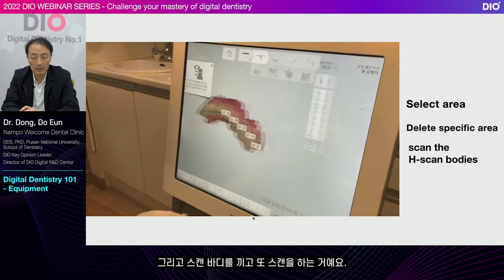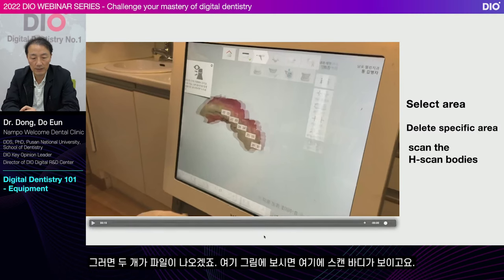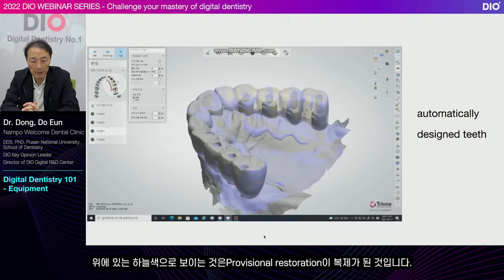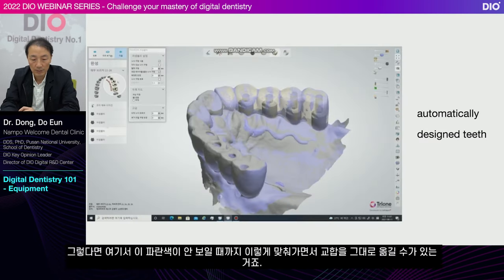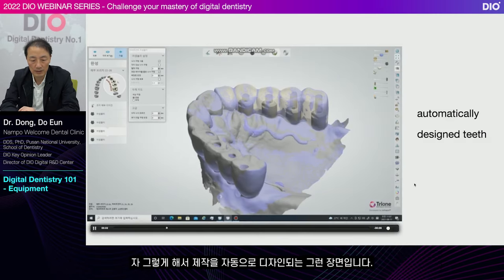Scan again with the scan body attached. Then you will get two files. If you see this image, you see the scan body here. The blue color on top is the copy of provisional restoration. So the tooth gets designed automatically. Then you can transfer the occlusion as is by adjusting it like this until you can no longer see this blue color. So this is how the automatic designing program works.